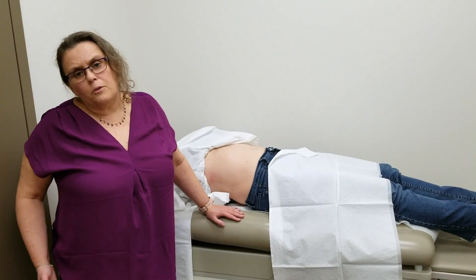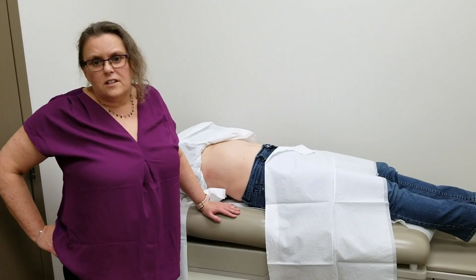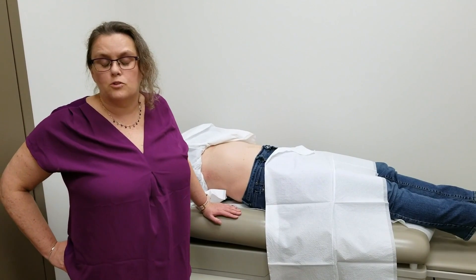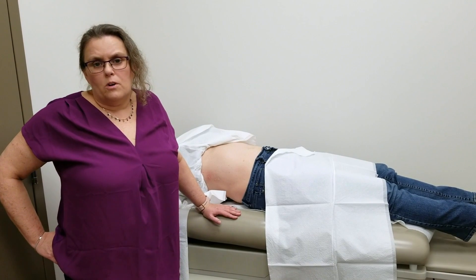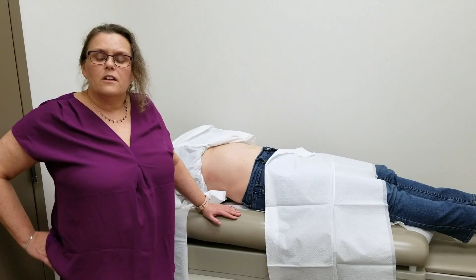The preparation for our patients is usually about four hours of nothing to eat, and some places will ask them not to have anything to drink as well. But bottom line, we really don't want them to have any big heavy meals because that can change what the result is.